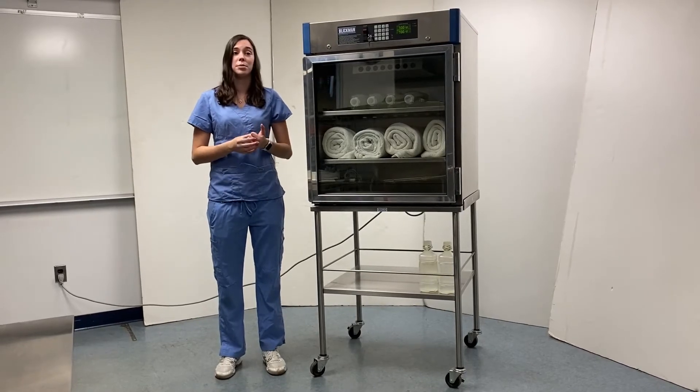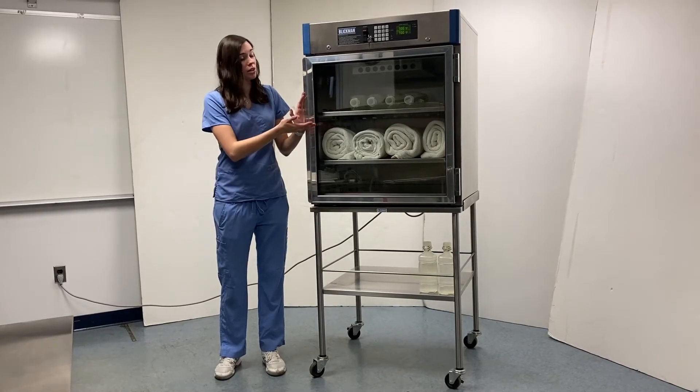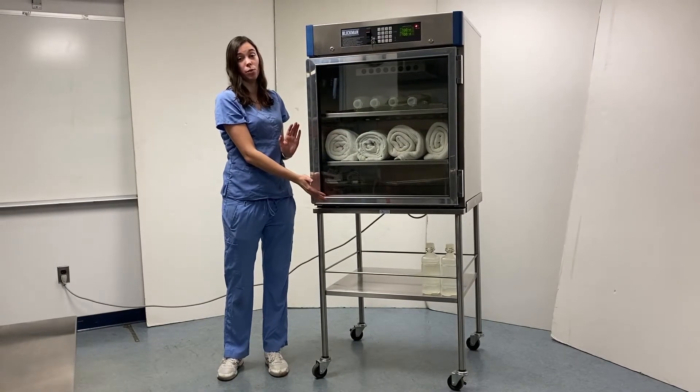Additionally, all of our warming cabinets come with either a glass or solid stainless steel door. On this model we obviously have the glass door in place so that you can easily view the contents at full width.